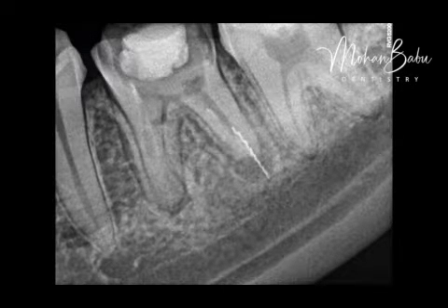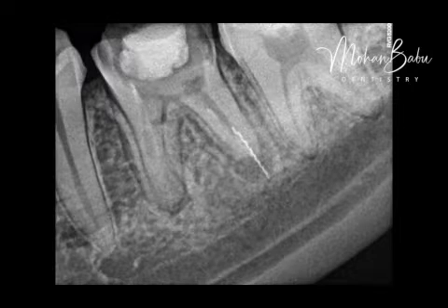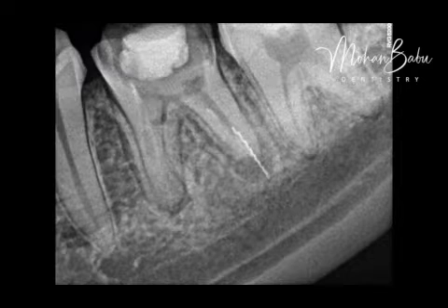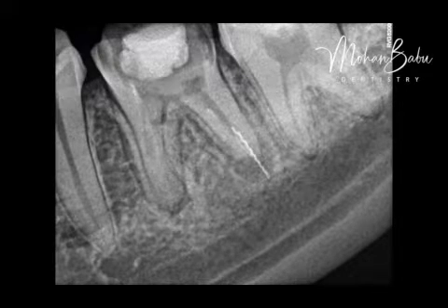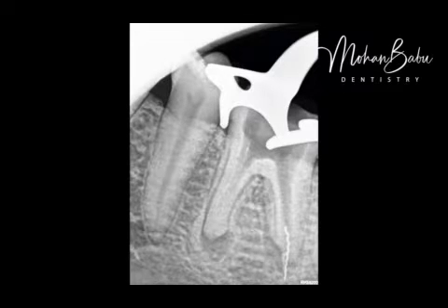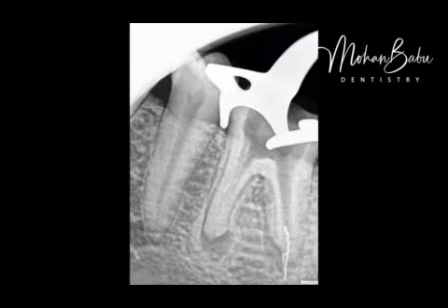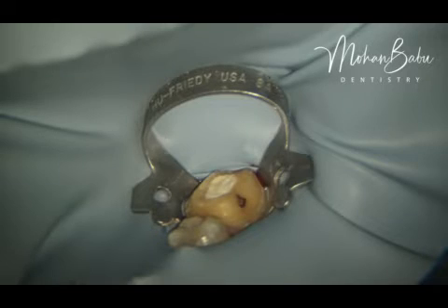This is a case of a fractured instrument in the distal root of the lower left first molar tooth. The same tooth has ledges in the mesial canals as well. This case is more challenging because half of the instrument is already beyond the apex in the distal canal, and the canal is wider — trying to retrieve the instrument may cause it to slip further beyond the apex. After removing the temporary materials, we can see the file in the distal canal, but not very clearly.